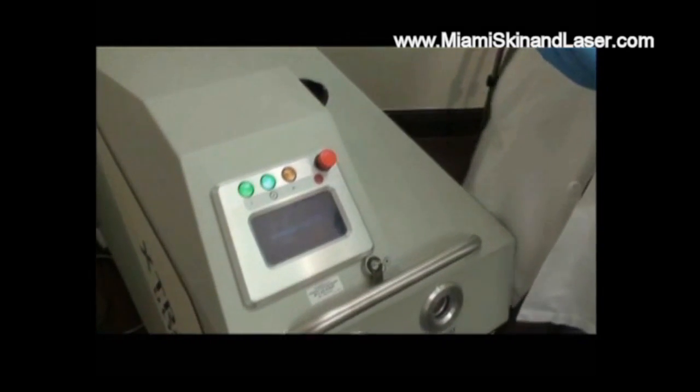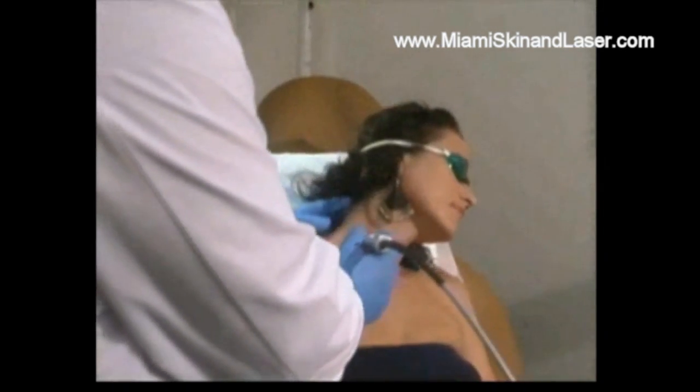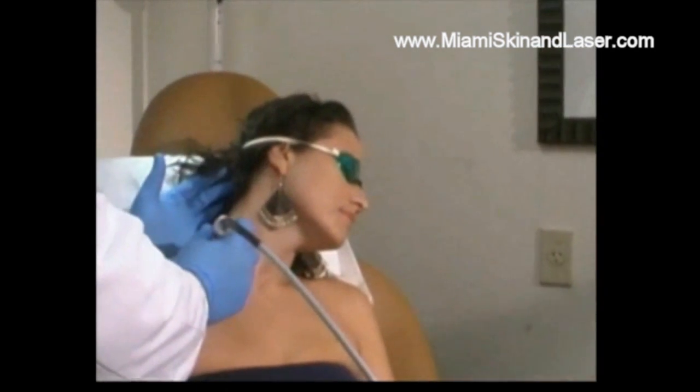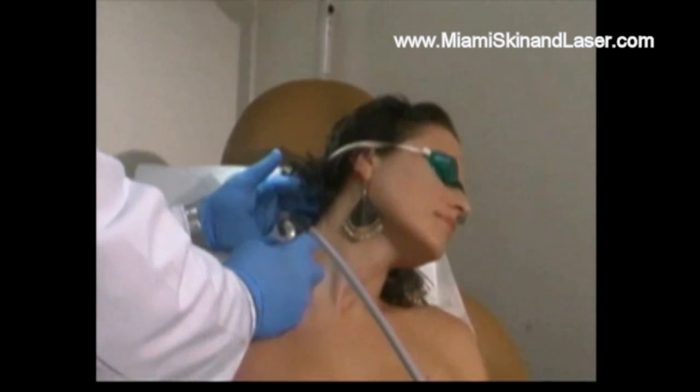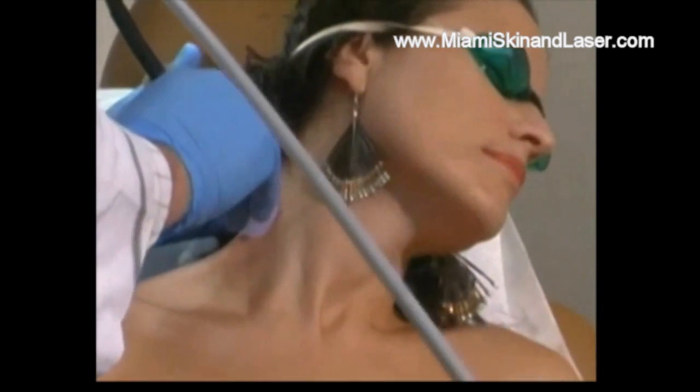Now we will go ahead and start treatment. We'll put these goggles over our patient's eyes. Although we're treating vitiligo and psoriasis with this excimer laser, we'll go ahead and treat it as such. The device is applied to the skin surface and the treatment pattern is determined, trying not to overlap and treating appropriately.